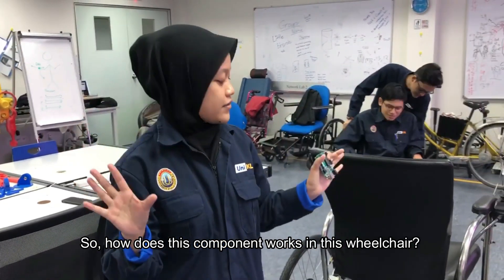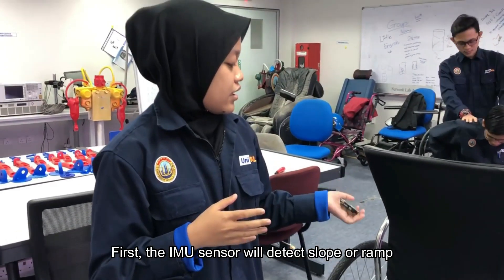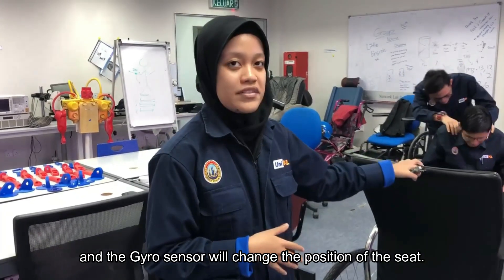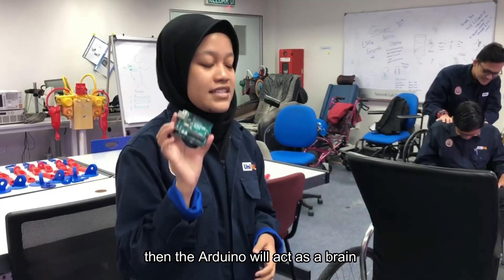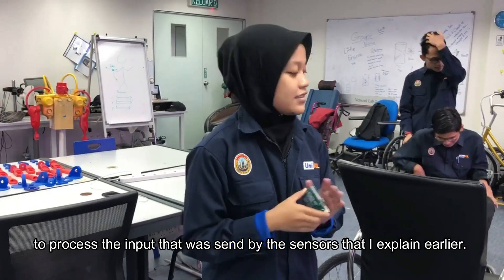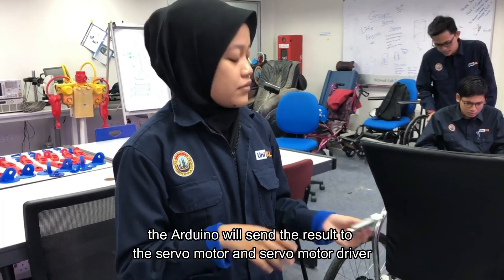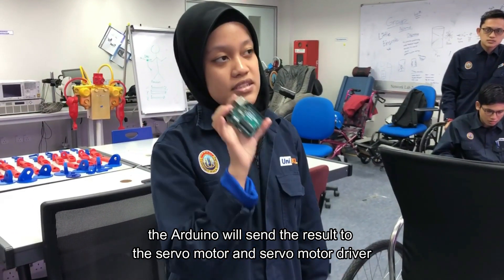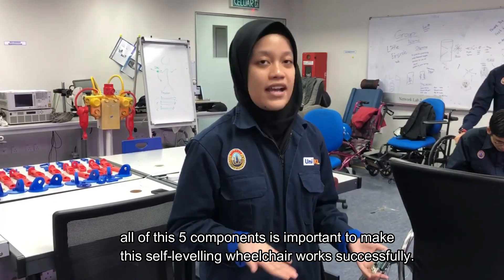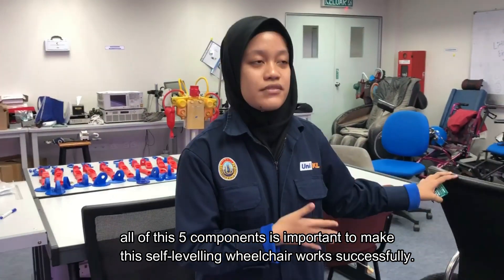So how do all these components work in this wheelchair? First, the IMU sensor will detect the slope or ramp, and the gyro sensor will change the position of the seat. Then the Arduino acts as a brain to process the input sent by the sensors. After processing all the input, the Arduino sends the result to the servo motor and servo motor driver to execute the action. In conclusion, all five components are important to make this self-leveling wheelchair work successfully.